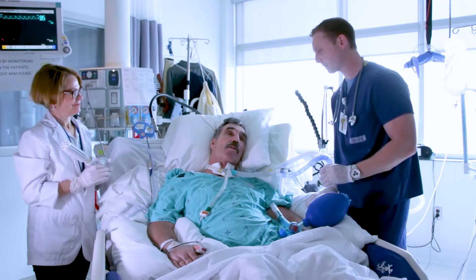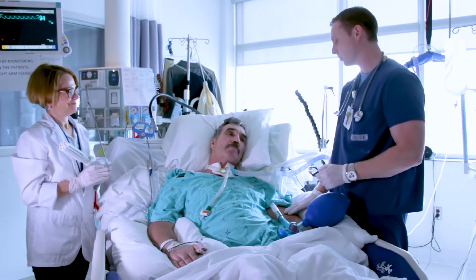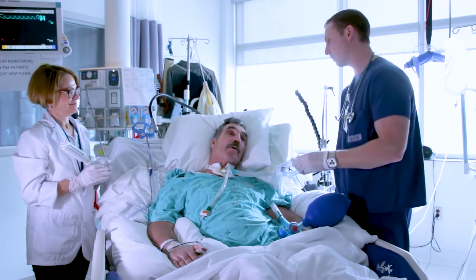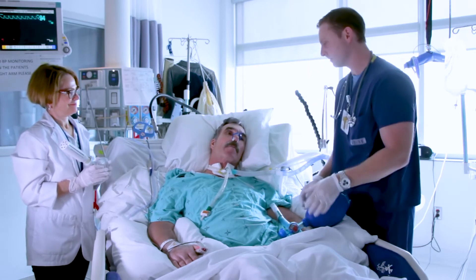So am I just going to cough or blow out? A cough out. All right. So when you're ready, I'm going to disconnect you from the vent. I'll place your nose clips on first. Are you ready? Ready.